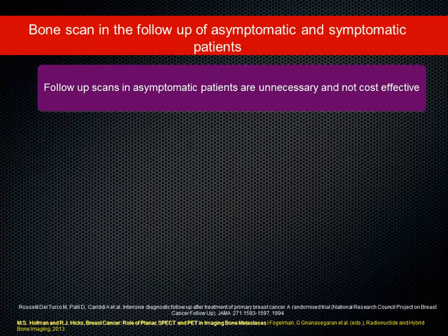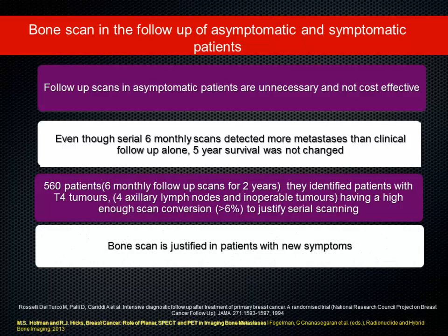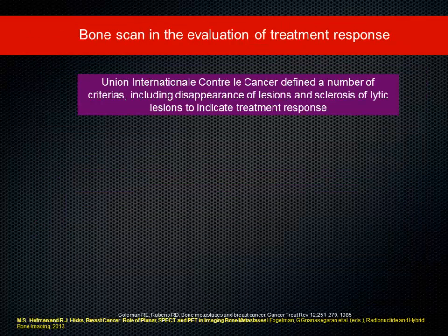In terms of follow-up, asymptomatic and symptomatic patients, some evidence again is controversial. Some say it is useful and some say it is not necessary and it's not cost-effective. And they have evaluated and they found that bone scan is justified only in patients with new symptoms. You can have a bone scan in the follow-up period.